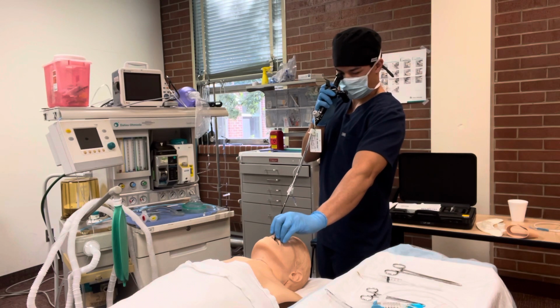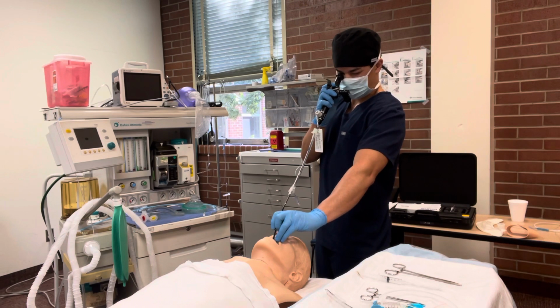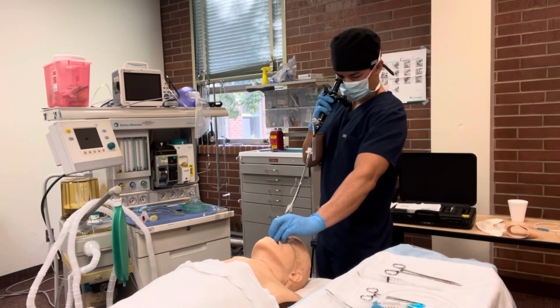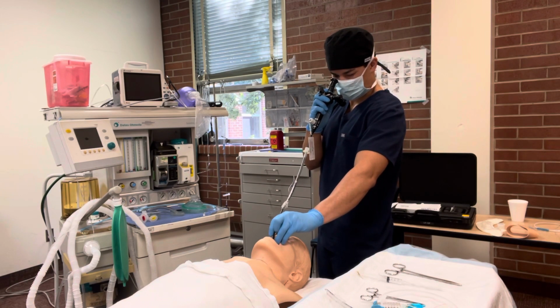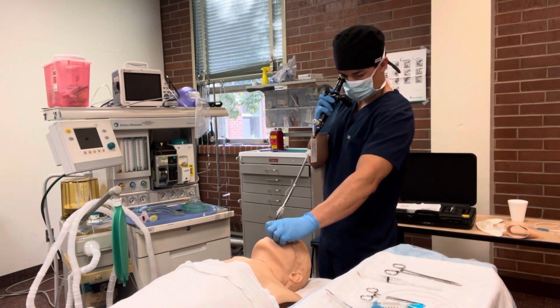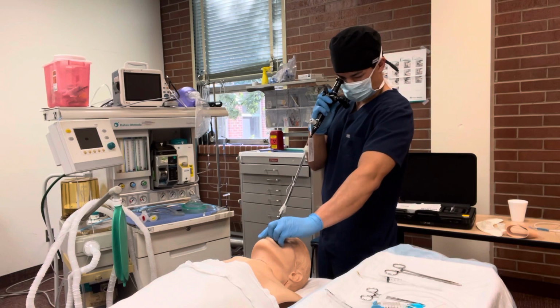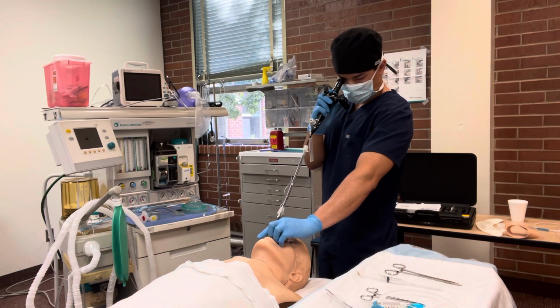I'm visualizing the vocal cords. And with this, I would have a bite block.